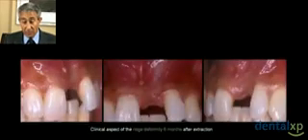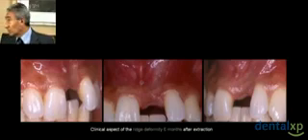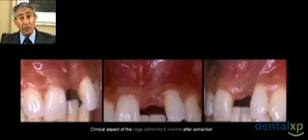We are at the same level on the natural tooth and on the final restoration. And this is the result after 3 months, thanks to Dr. Okawa, who is a fantastic restorative dentist. Now, we finish with the temporary final restoration, which also works and has an enormous influence on the soft tissue.